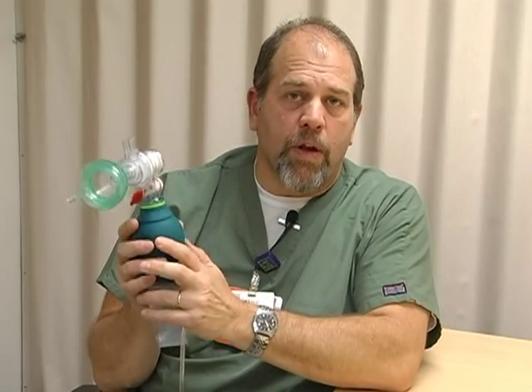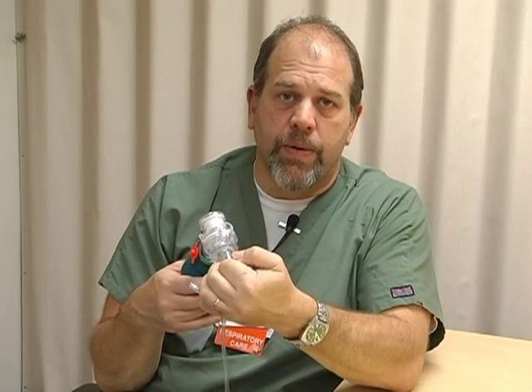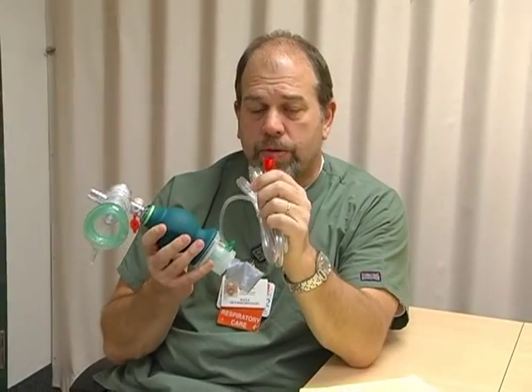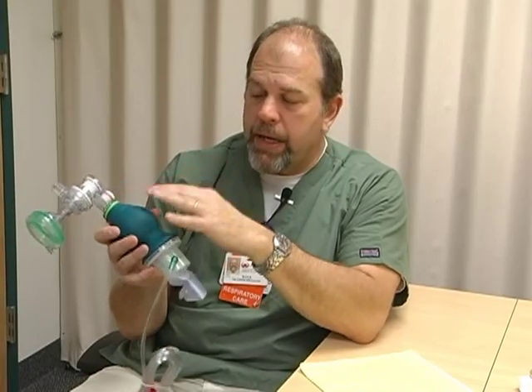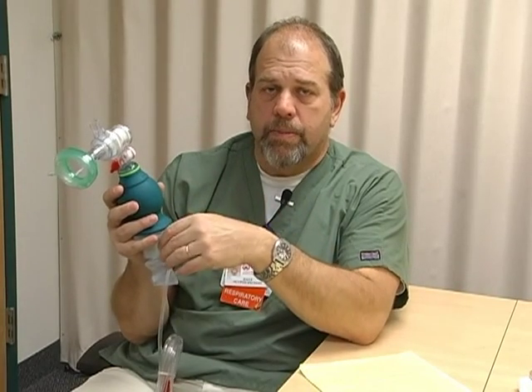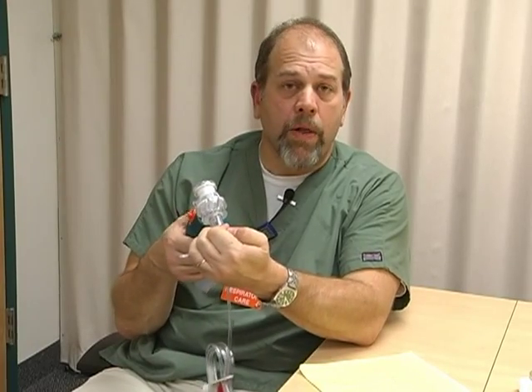One more thing: you want to use at least 10 to 15 liters of flow with this particular bag so you can get sufficient pressures and delivery to the baby. The tubing is nice — it's a fits-all end that screws or pushes right up onto the flow meter. This bag delivers 21% or whatever percentage you have it hooked up to with the blenders and analyzers we're presently using.